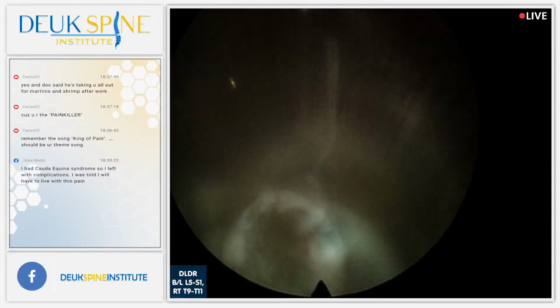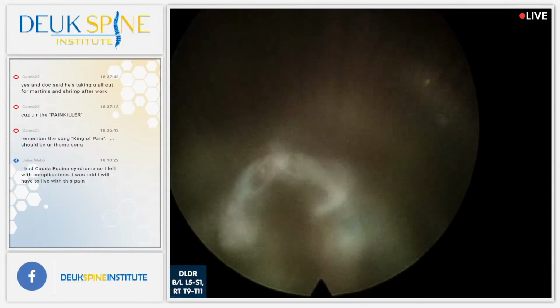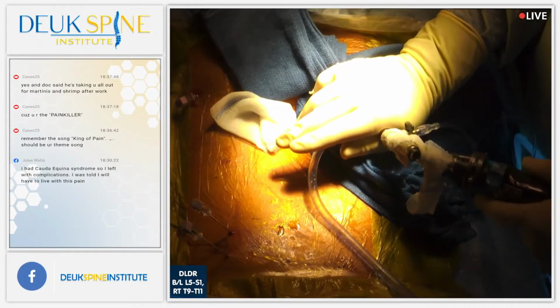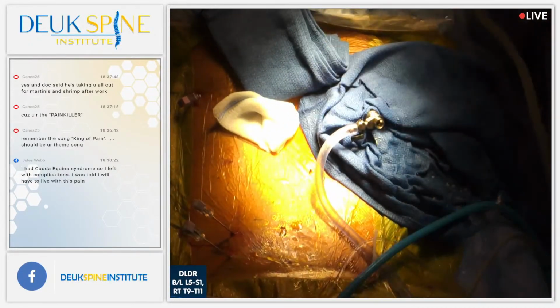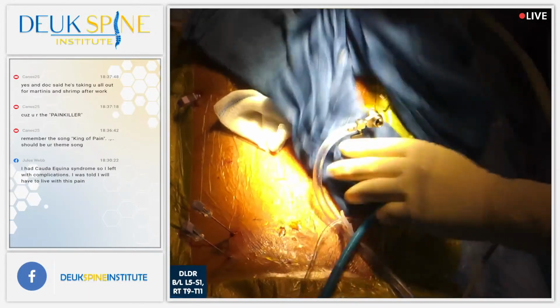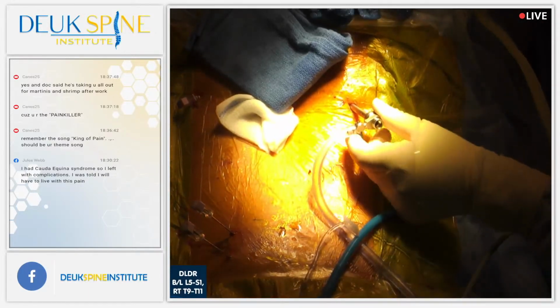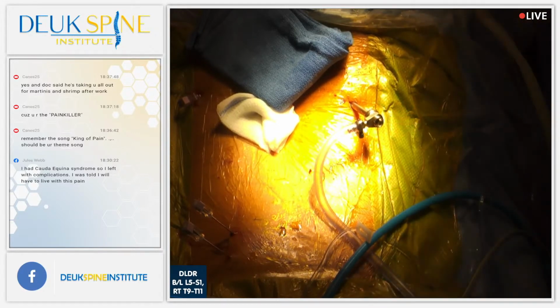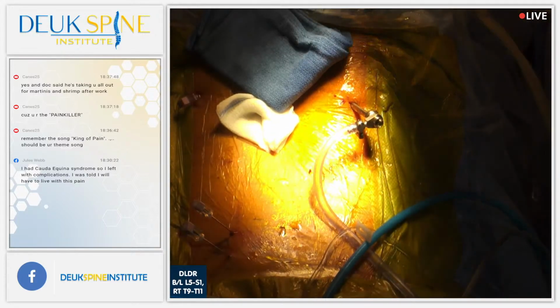There's nothing there. Good job. Nice one. Thank you. That went very well. Luis, should I switch sides with you then? Yeah, I think so, right? Come over there. All right. Little antiseptic. Little irrigation.